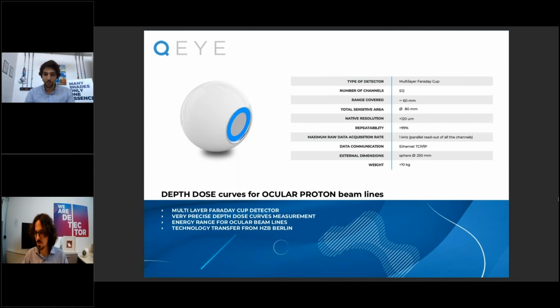We are working on creating this quick QA with a pre-configured set of analysis parameters and pre-configured analysis to perform automatically or with the click of a single button. But as soon as we have this functionality, then we can also schedule that click, let's say. So we can make a plan and make this click for the quick QA automatic.